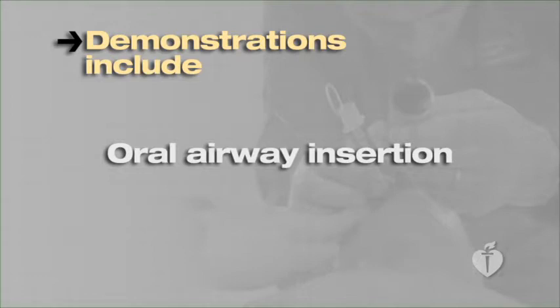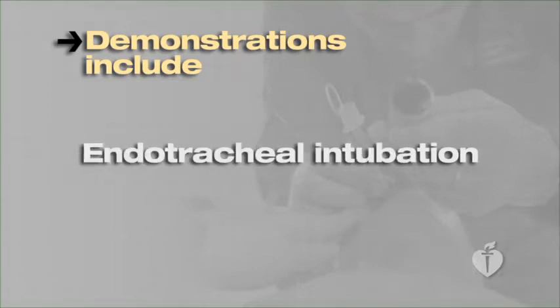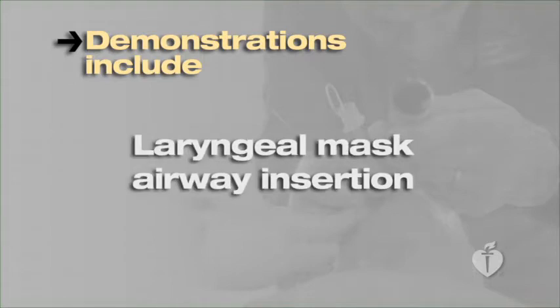your skill stations. These demonstrations include oral airway insertion, bag mask ventilation, endotracheal intubation, and laryngeal mask airway insertion.